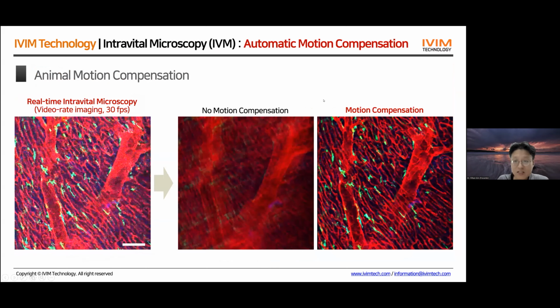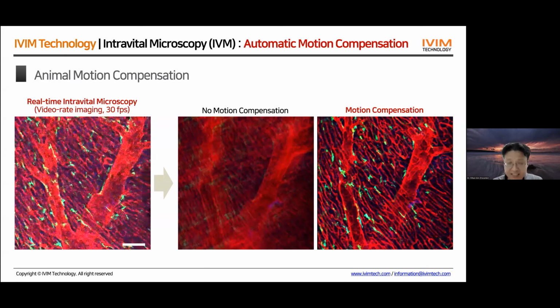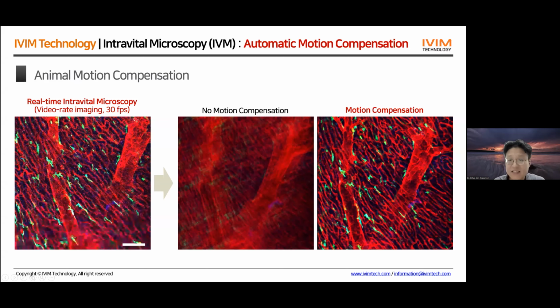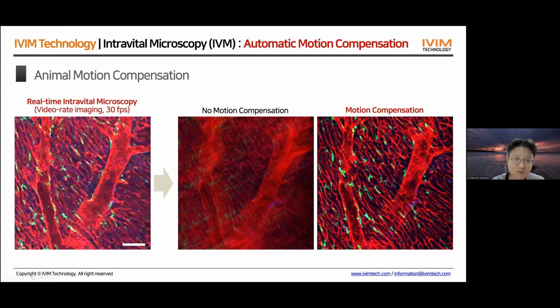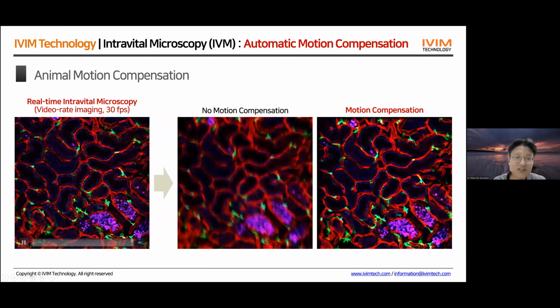This motion compensation function is very essential. It's indispensable to obtain high resolution, high quality, motion-stabilized imaging from live mouse tissue, as I show in this slide.